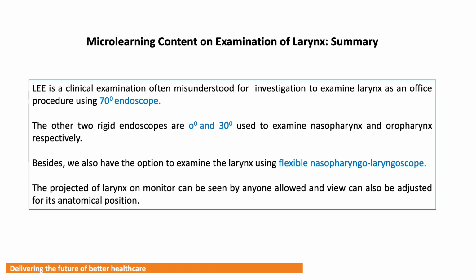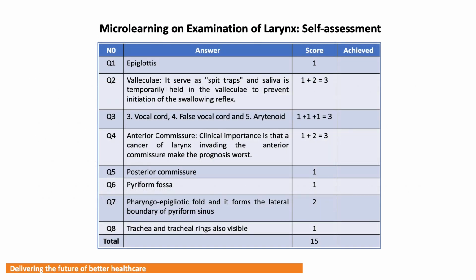The projected view of the larynx on the monitor can be seen easily by the trainees, patients, or their attendants if it may be required. Now it's time to check your quiz correct answers, and if you score less than 10 marks, it's time to revisit your anatomy of the larynx and watch this video again.